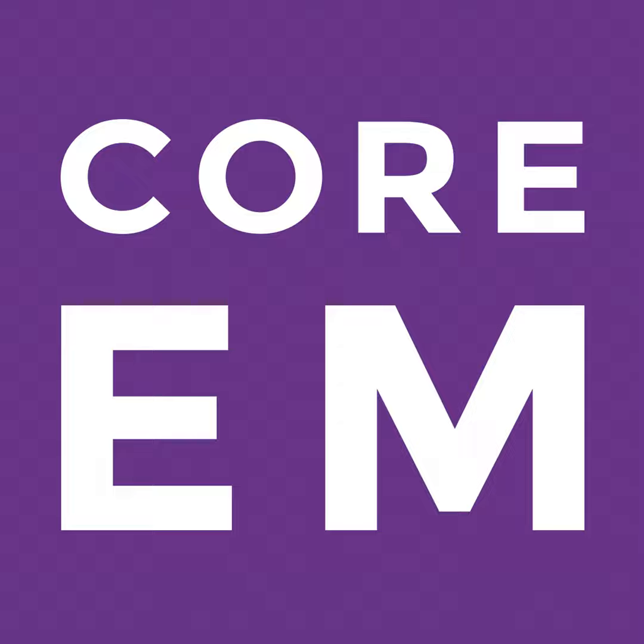Torsade isn't tricky either, though it rarely looks like what you see in a textbook. I'll drop a couple of EKGs in the show notes to review this. AF with WPW is another scary-looking one. You'll typically see bizarre complexes, maybe some fusion beats, and there are going to be stretches where the rate is very high, approaching 300 beats per minute.